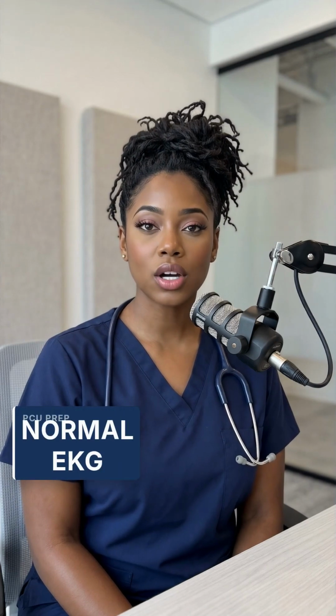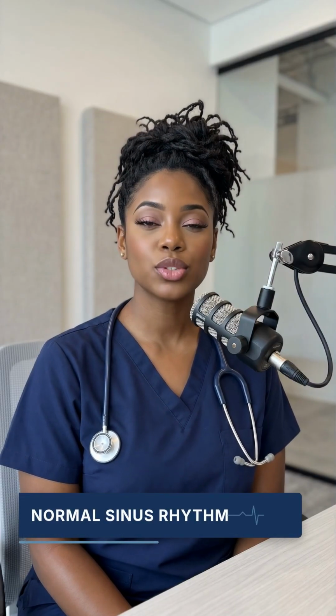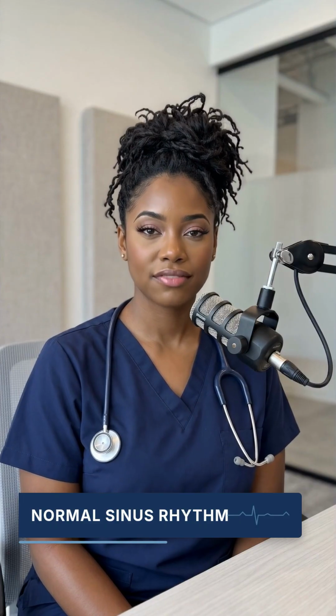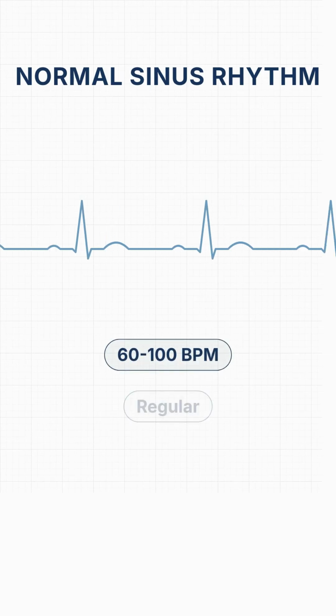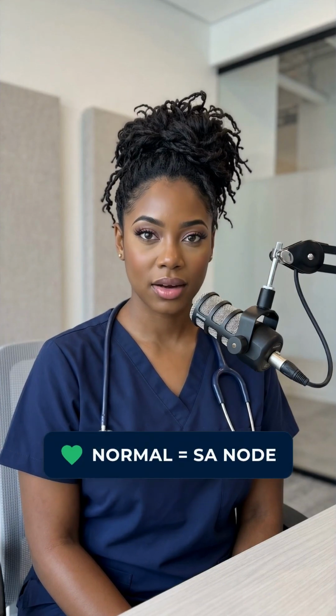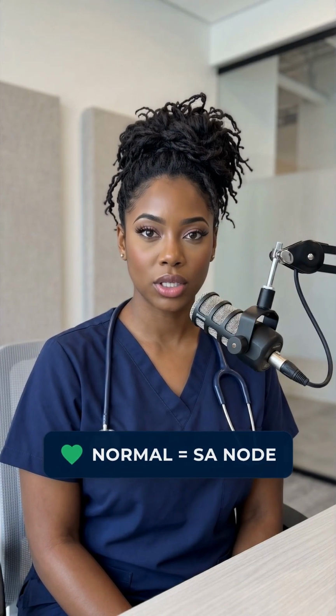Alright, before we talk about abnormal rhythms, you need to know what normal looks like. Normal sinus rhythm means rate is between 60 and 100. Rhythm is regular, and every P wave is followed by a QRS. The heart should fire organized from the SA node with a regular rhythm between 60 and 100. If all of that checks out, you're looking at a normal rhythm, organized right from the SA node.